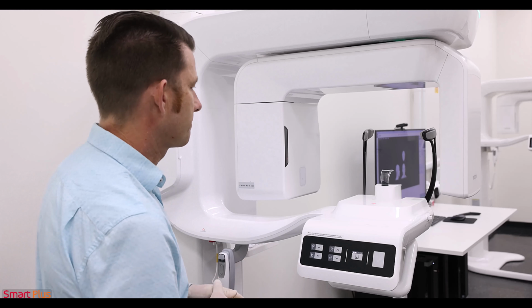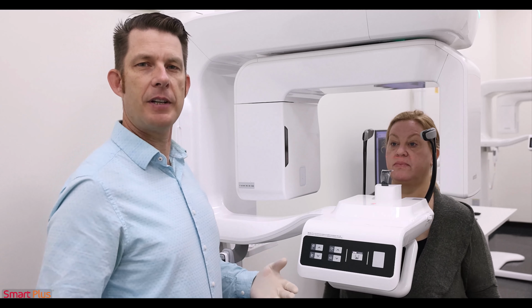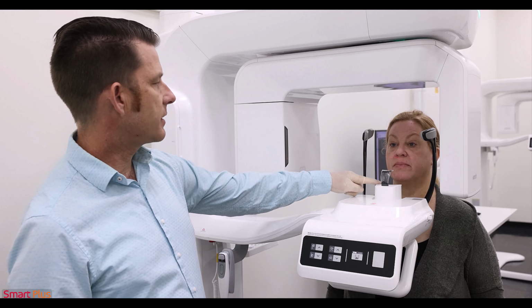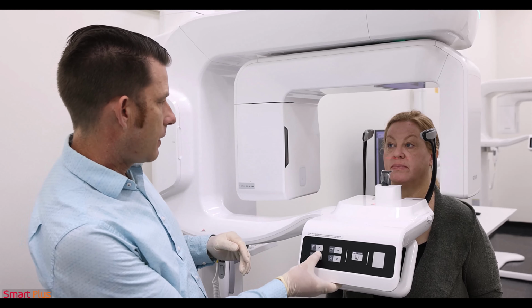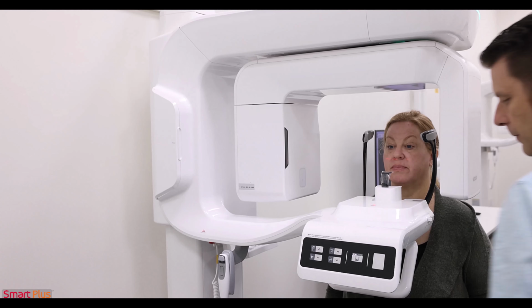Go ahead and stand up straight and tall for me. I always have the patient stand up at attention so we don't have any slouching or issues there. The first thing I do is I ensure that the chin rest is just below their chin. So I can move the entire device up or down, but I want to get that right to the base of their chin.